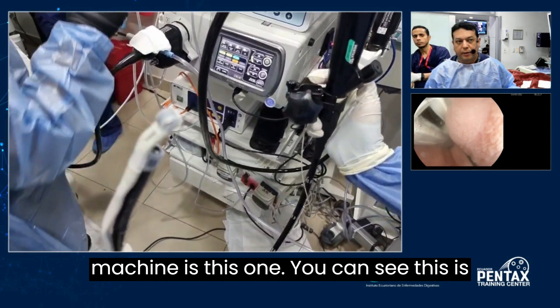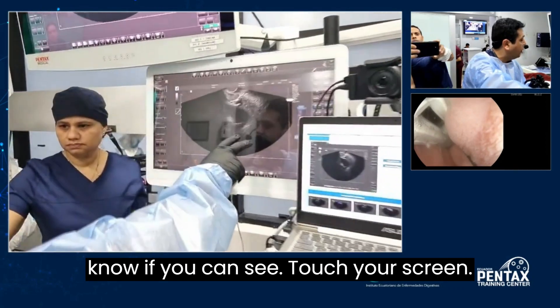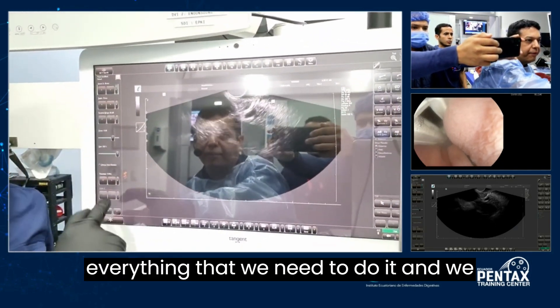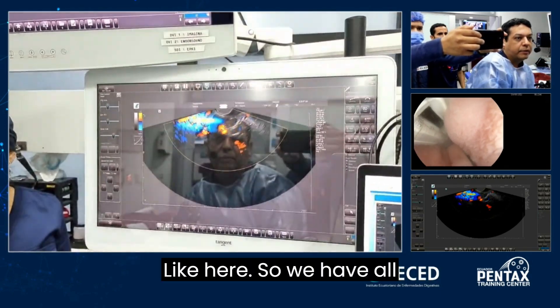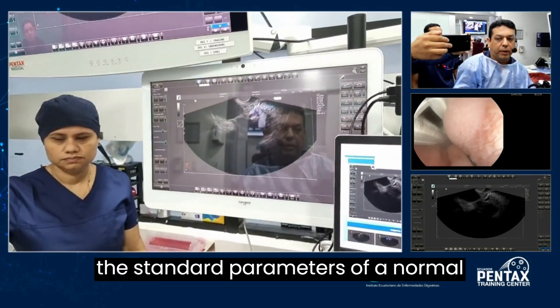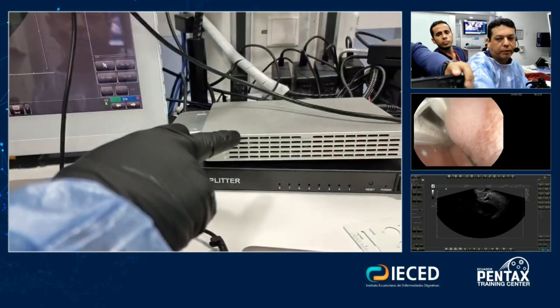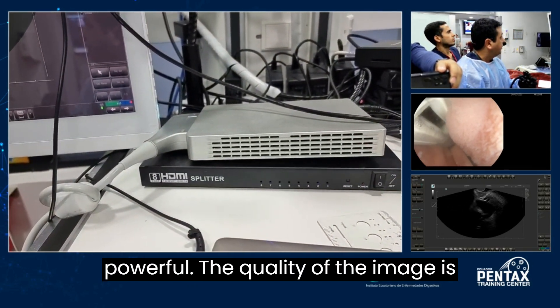And the machine is this one. You can see this is a touch screen. We have all the range, all the gain, power, frequency — everything that we need to do it. We also have Doppler right here. So we have all the standard parameters of a normal machine. The machine is really small but very powerful. The quality of the image is very good.